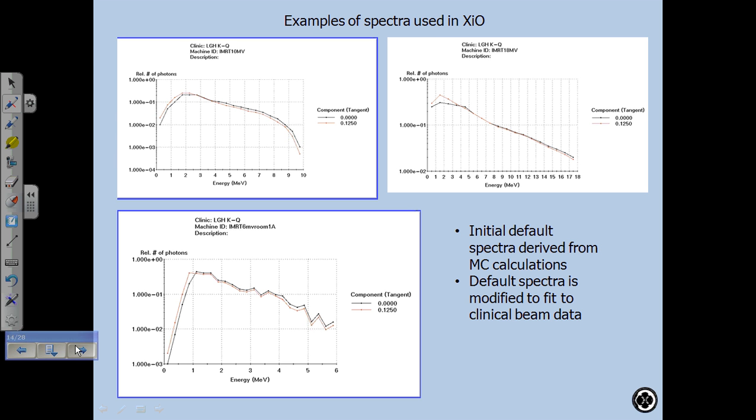Because the amount of high energy and low energy photon contributions are different, obviously it's going to affect the PDD, right? I mean, if I take this end right here, and I make these all straight, so we have a lot of 10 MeV photons, what's that going to do to my PDD? I can give you an example here. So here's a PDD with a 10 MeV beam, and now I'm going to take this and straighten this out. Now my PDD is going to look like, why don't you tell me what it's going to look like? This is depth, and this is PDD.